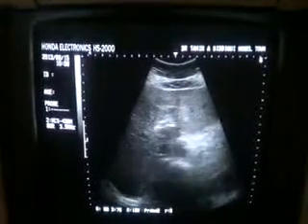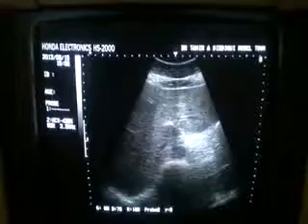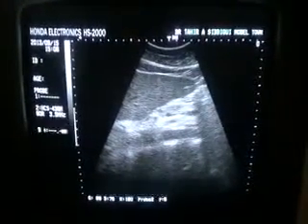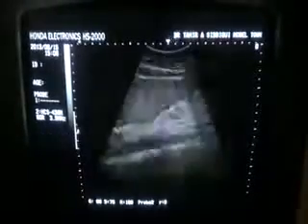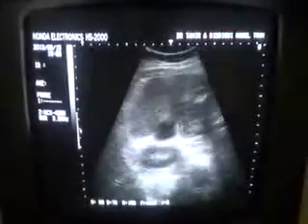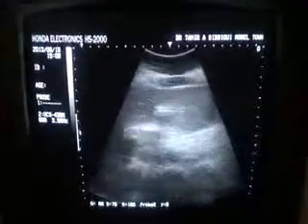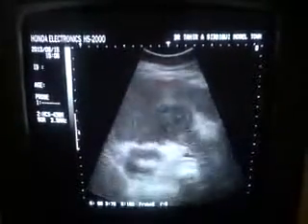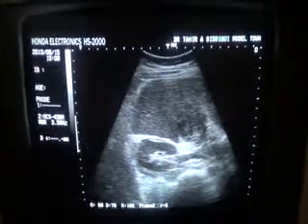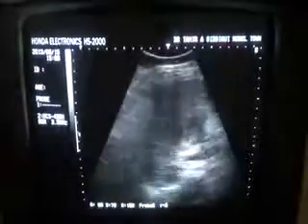Here we see both right and left lobes. The angle is sharp. The angle is rounded. I can see the liver below the costal margin. Here I am giving a sweep to the liver below the costal margin and I can see the liver parenchyma. Here we see the kidney in transverse section and the hilar region as well.